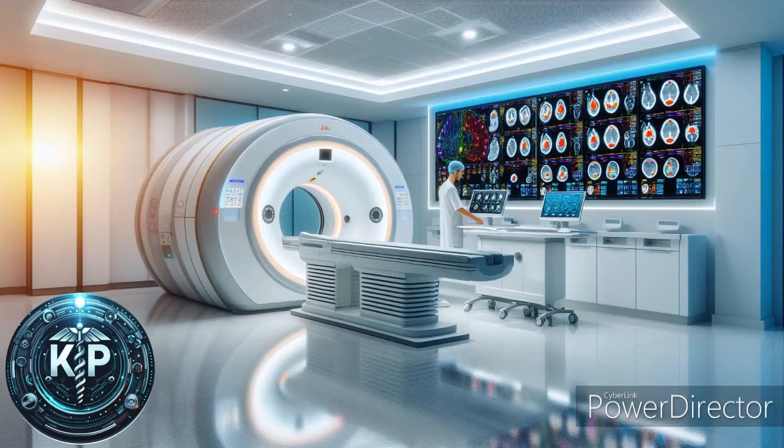Scintillation crystal, usually made of sodium iodide. This crystal scintillates, glows, when struck by gamma photons. Photomultiplier tubes, PMTs. These convert the light from the scintillation crystal into an electrical signal. Positioning logic determines the location of the scintillation events within the crystal. Computer system processes the signals from the PMTs to reconstruct the 2D projections into a 3D image.